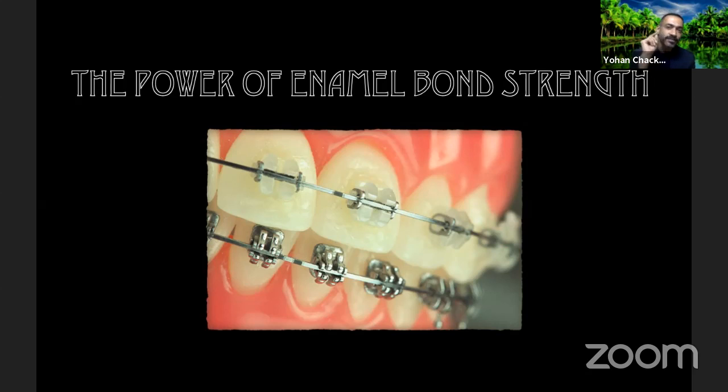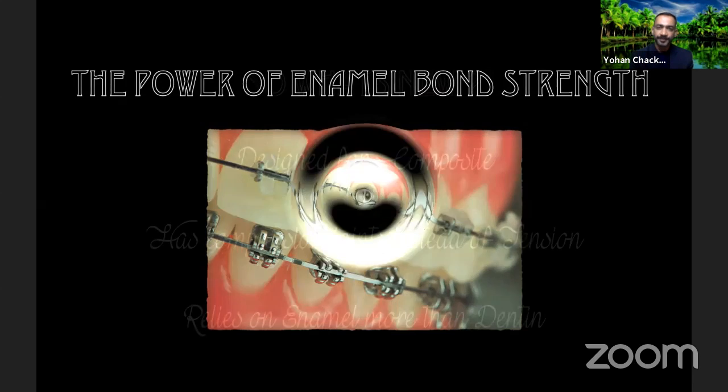And that is what you have to harness every time you do a composite restoration. Just remember that the enamel bond is very strong. The dentine bond, no orthodontist, I promise you this, no orthodontist will bond a bracket to dentine. They will never do it. They know this better than us. They know the power of the enamel bond. That's why they harness the enamel bond. And that's why we as restorative dentists have to start changing our preparation to harness all this enamel that is there. The greater the enamel spread, the more stronger your composite restoration becomes and the more retentive it remains.